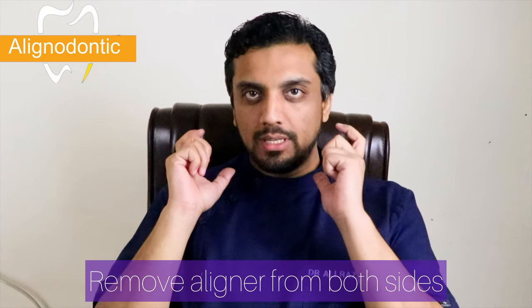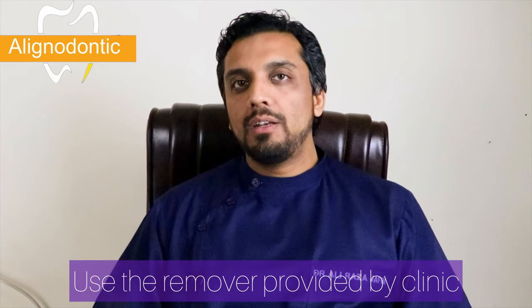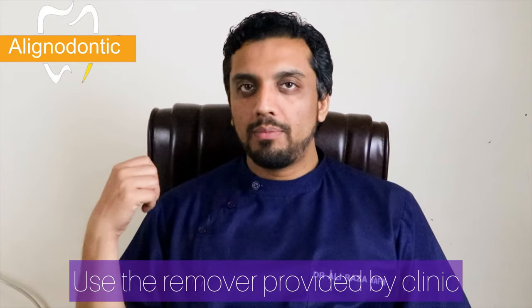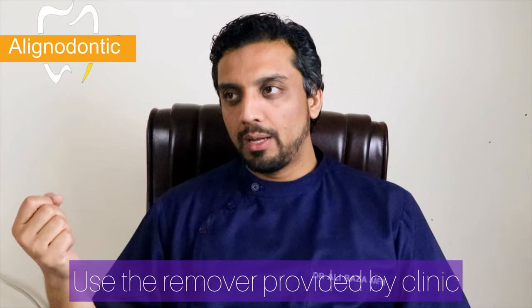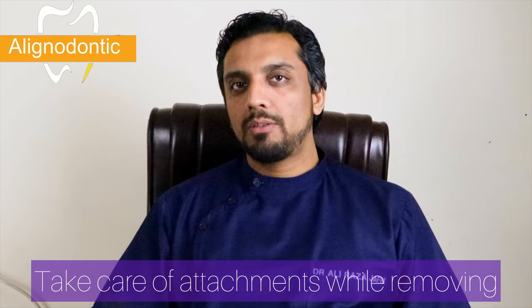The next category is how you have to remove the aligner, especially when you have attachments. You have to remove the aligners from both sides — you have to engage your nail, or use a special aligner remover which you hook and lock. If the anterior or posterior teeth have attachments, then you will focus more on the attachment areas.